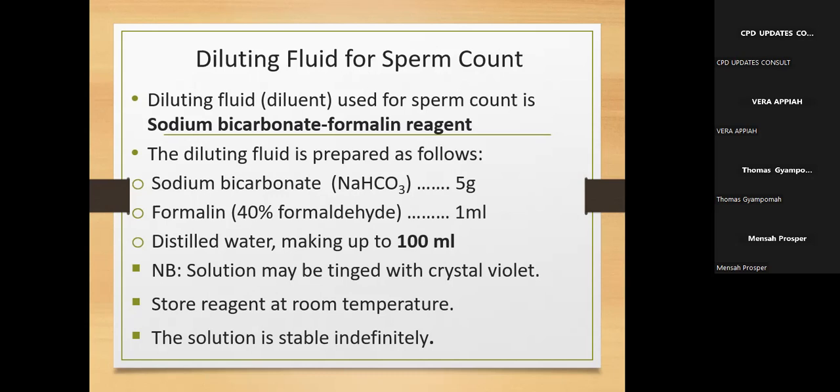So the WBC diluting fluid, which is 2% acetic acid, is called Turk's fluid. Take note so that when students come to your facility and are going to write external exams, these are the things they ask. They won't say WBC diluting fluid. No examiner will say that. They'll mention Turk's fluid, and Turk's fluid is the WBC diluting fluid.